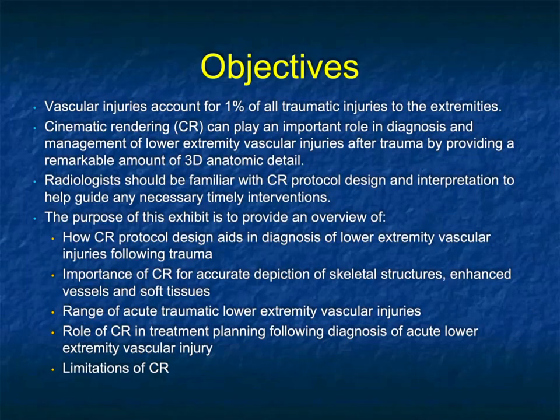The purpose of this exhibit and this talk was to provide an overview of how CR protocol design aids in diagnosis of lower extremity vascular injury, and the importance of CR for accurate depiction of the non-vascular structures as well, be it the bone, the muscle, or soft tissues.